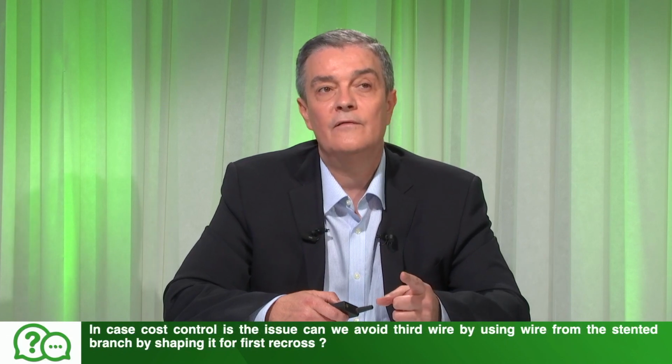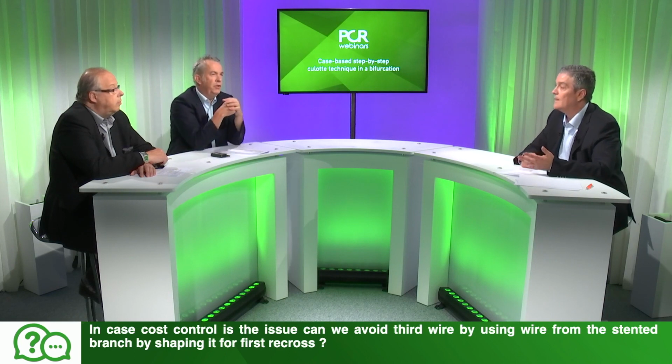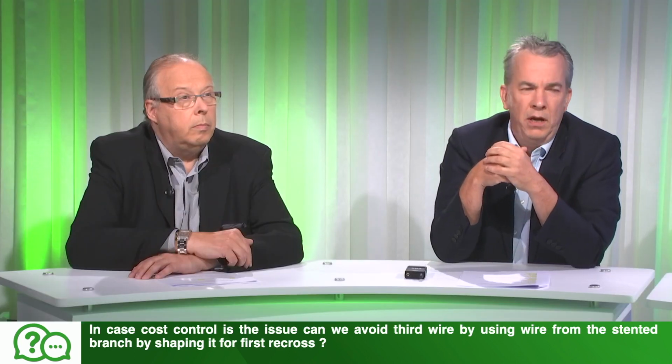By shaping it for the first recross, Dave, you said you used the third wire. Yes, you can do, but you know, one day you'll wish you hadn't pulled the wire out of the main vessel. So, you know, the wire is a rather small proportion of the cost of these cases.